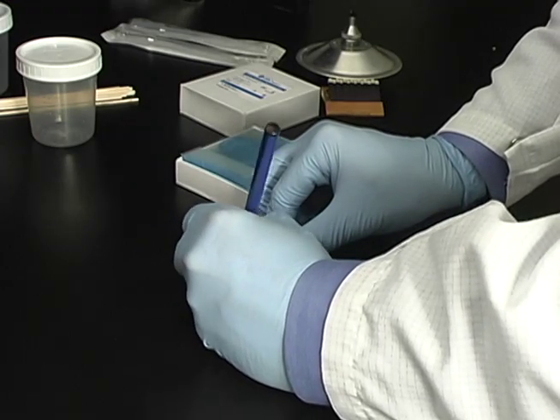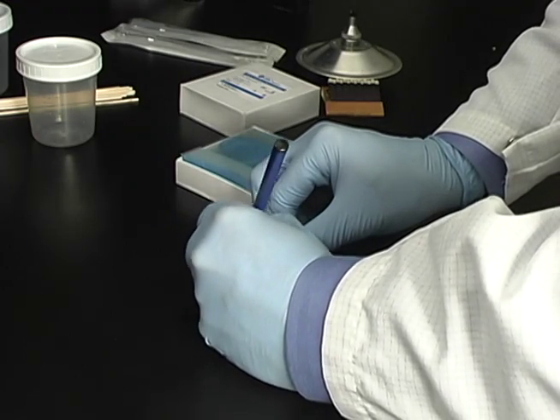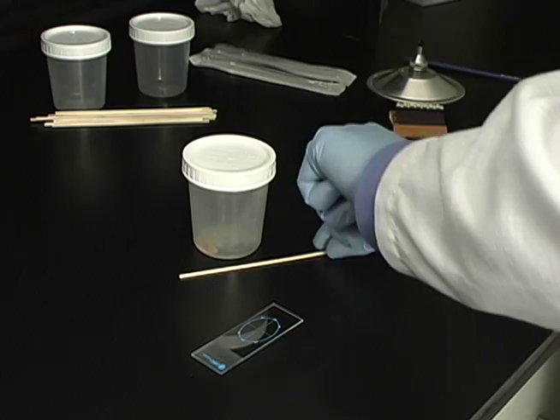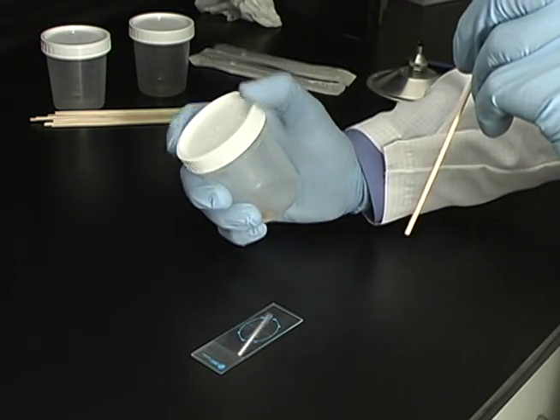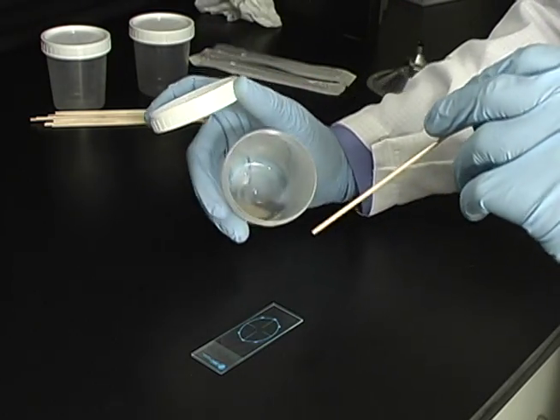Properly label the slide with the patient ID number, as dictated by your laboratory protocol. Once the pulmonary sample has been collected, use a wooden applicator stick to remove a small portion of the mucoid specimen.